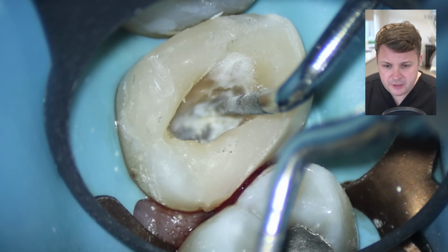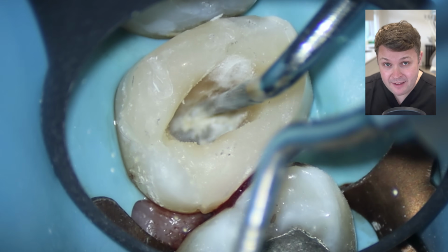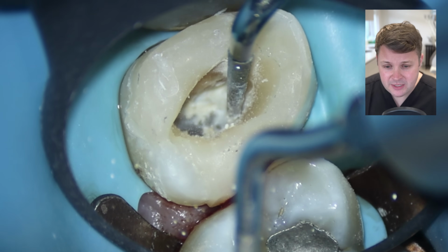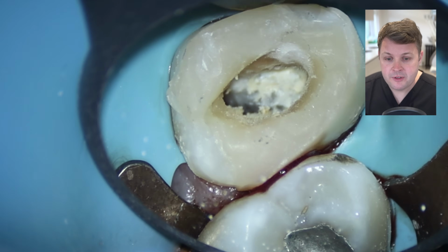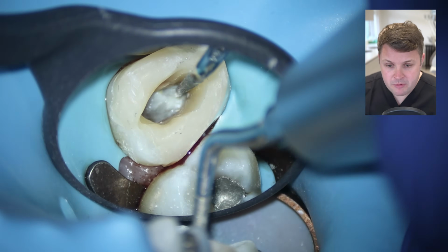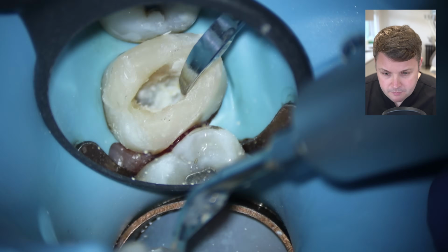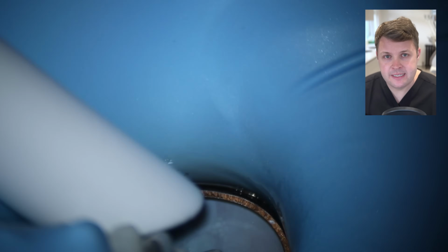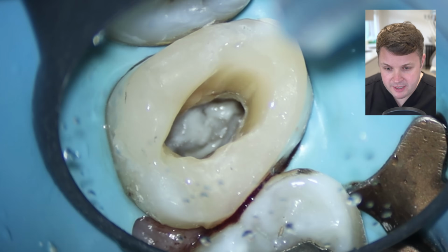And when we have a little feel around here, of course, I like to use it without water. Got to be careful, of course, you don't cook the periodontal tissues. And this is on very, very low energy. Once we have had a little bit of an investigation around this, the powder needs to be removed with a high energy ultrasonic and a bit of irrigation. But I'm pretty convinced that the DB is where I initially found it.